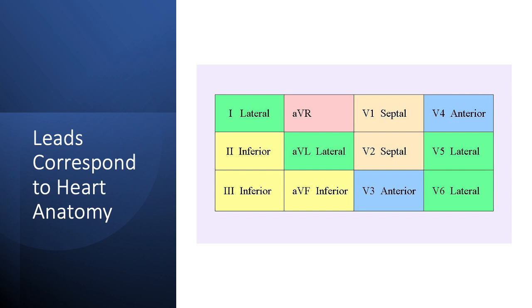So an electrophysiologist may have some interest in what's happening in AVR. For us, we still consider it kind of a throwaway lead at our level of learning for the ECG. So I just wanted to give you guys a little bit of a heads up about why we don't really look at it, but why it still is an important lead for some of our cardiology colleagues.